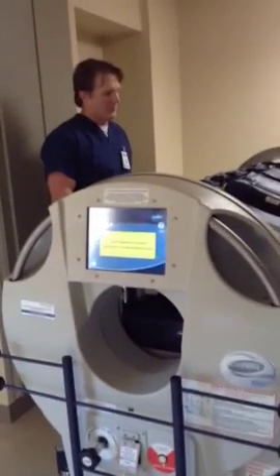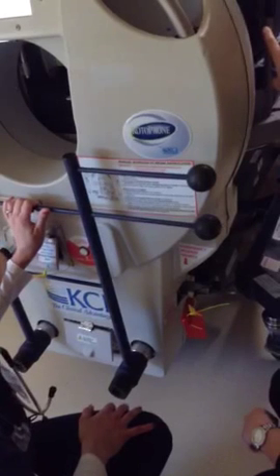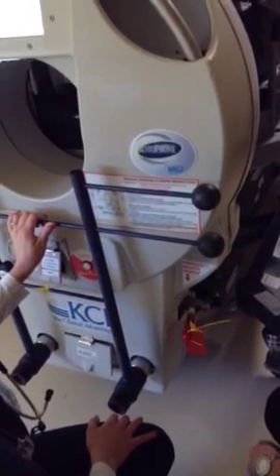And then one person come here. So you're going to come to the foot of the bed here. You're going to pull the emergency release, which is here. So you're going to release it here, okay? You're going to say, is the patient secure? Is the patient secure? Yes, the patient's secure.